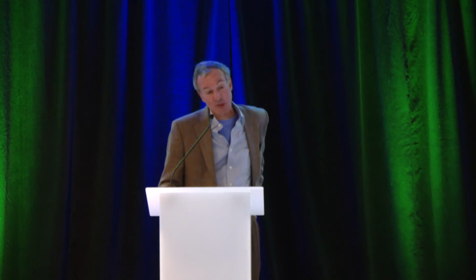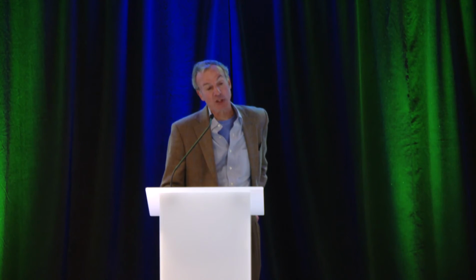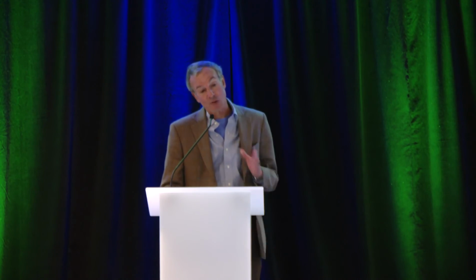So this was the first type of device that was invented. It was a syringe perfusion pump. So the water is in the pump, it mechanically pushes water in, you have a catheter going into the esophagus, the squeeze in the esophagus opposes that flow and it registers the pressure to the recorder. The syringe pump perfusion, and if you can do it with one, well then a better mousetrap, the pneumohydraulic perfusion pump.